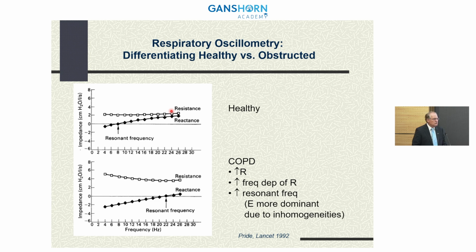If you have no difference between those values, then that is what you typically see. R20 versus R5 is not significantly different. Same with reactance, it's not different.